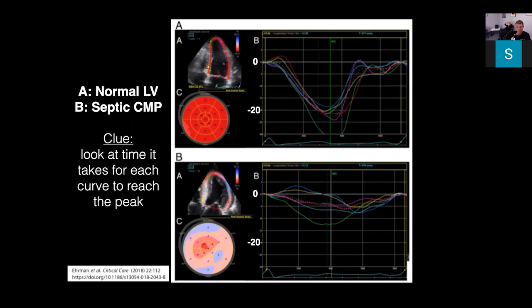So other interesting information you can get might be exactly how well the heart is contracting in terms of synchrony. What we mean by that is you should be seeing all the segments contracting together. That is a heart contracting in synchrony, a heart that will be ejecting blood in an efficient manner. If you get different segments contracting at different times, you will get dyskinetic motion.